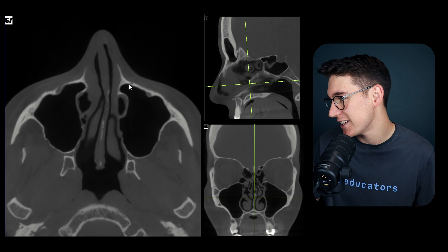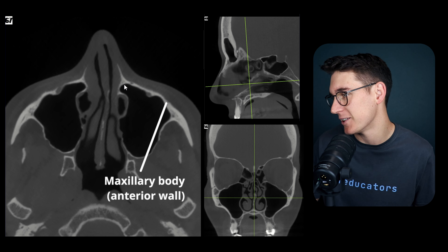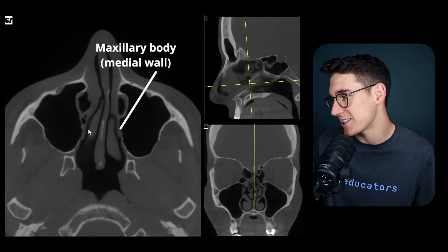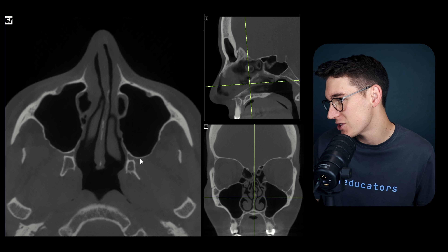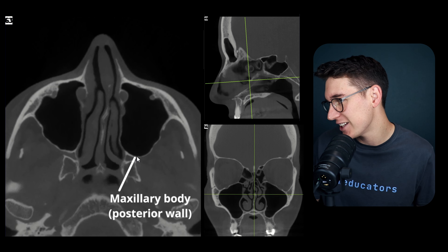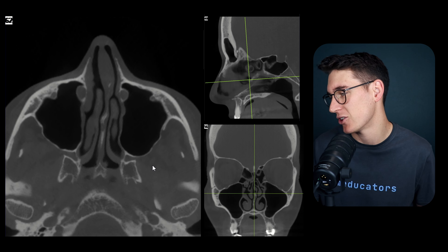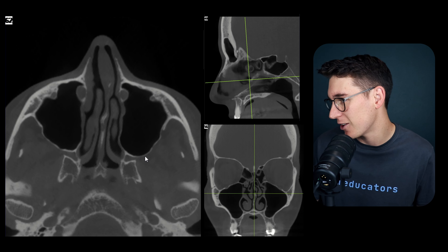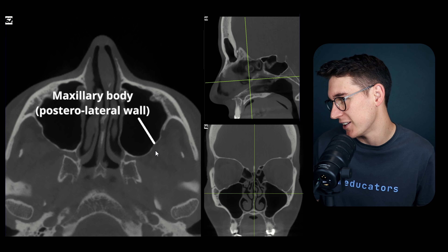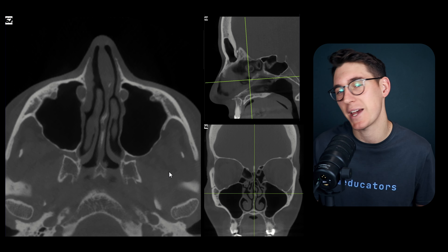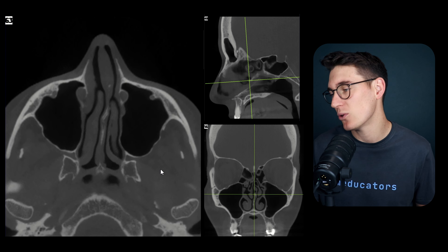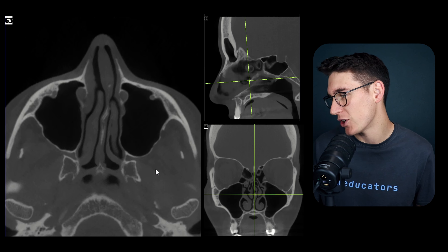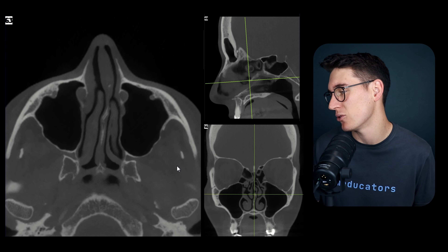We can see the anterior wall of the body here. The medial wall makes up the lateral walls of the nasal cavity. The posterior wall makes up the anterior boundary of the pterygopalatine fossa, and the posterolateral wall of the body faces out towards the infratemporal fossa. It's called the infratemporal fossa because it lies below the temporal lobes.